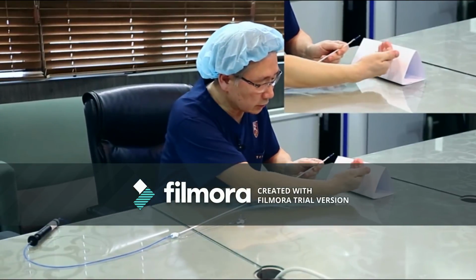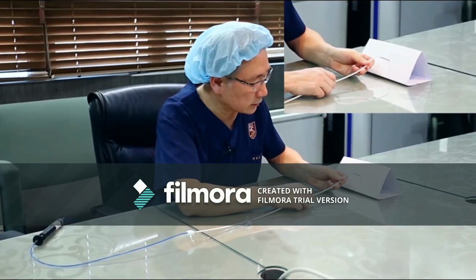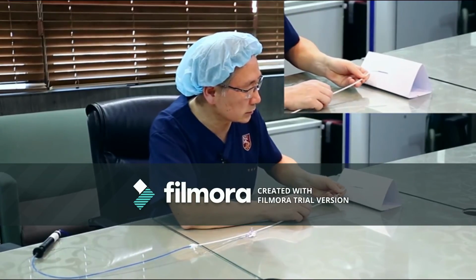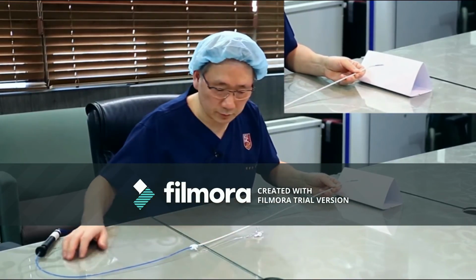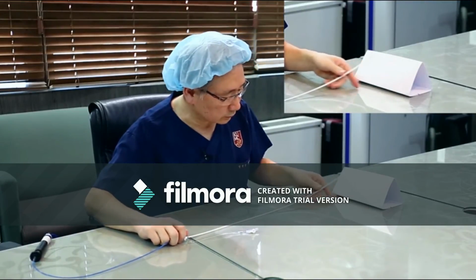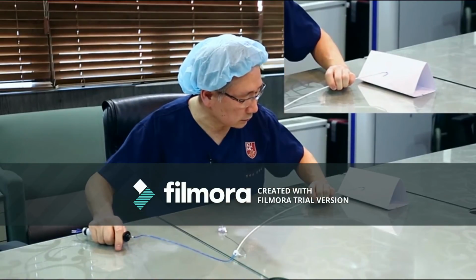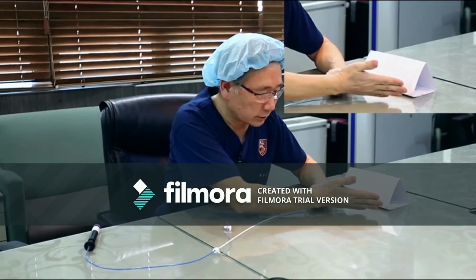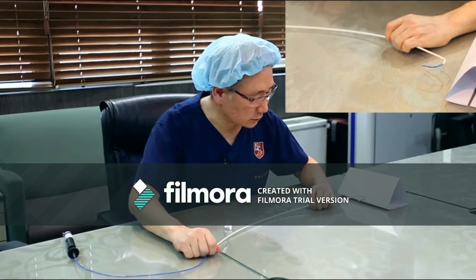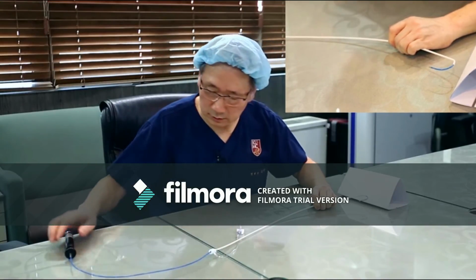For example, here's the roof. Directly contacting from here to here is not easy. Very slippery and very difficult to position for this linear ablation. So I prefer here, insert a little bit more, then curve down. Curve down. Here is the mitral annulus. Almost touch the mitral annulus like this. Okay, more.